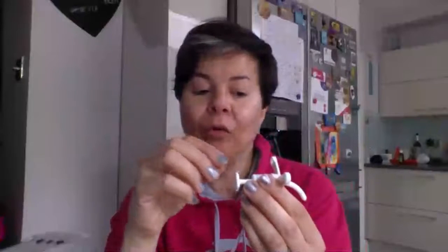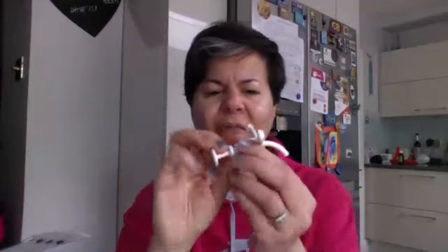Bivonas can be worn for up to 4 weeks, at which point you take it out, put a new one in, and then you boil these to make them clean again. You wash them and then you boil them, and then you can reuse them up to 5 times. Although I tend to reuse mine up to 3 or 4 because Zoe gets them dirty and they just start to wear, and I don't really feel safe leaving it till 5.